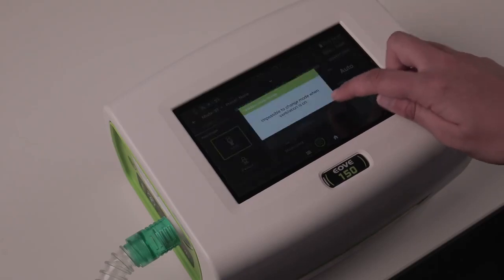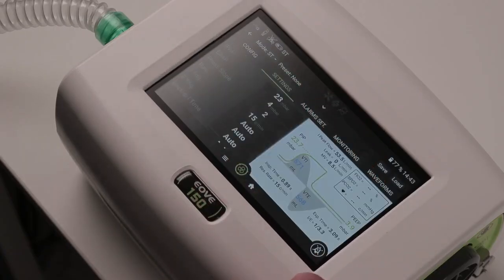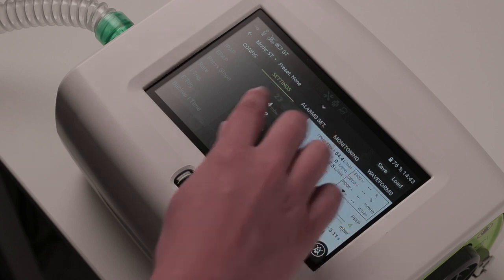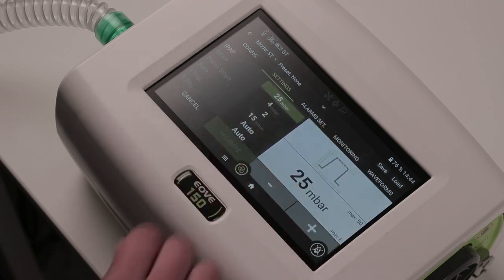From the settings tab, you can set the ventilation parameters. For that, you need to select the parameter you want to modify, adjust it, and validate.